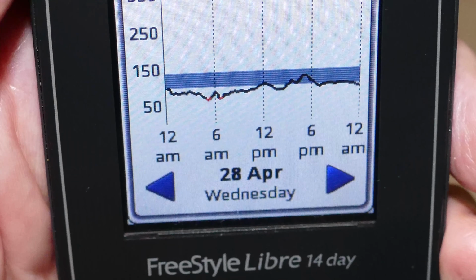However, I will often experience a drifting upwards from the morning when I have my butter coffee or bulletproof coffee until I eat my lunch. And if you look at Wednesday, you can see that's exactly what's happening. On Wednesday, I would have had bulletproof coffee probably around 9 a.m. And so it had started to drift up even before I had that coffee.